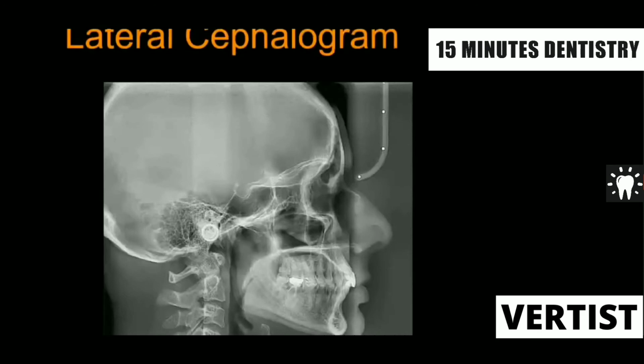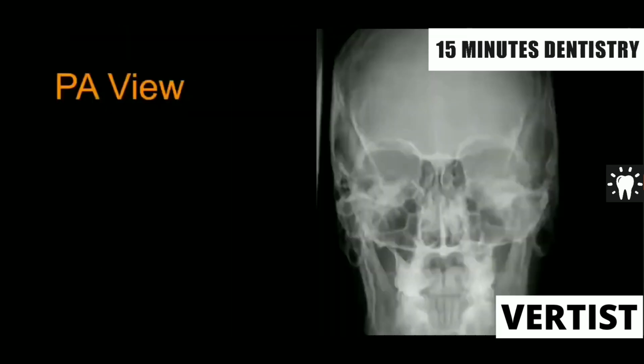So this is the lateral cephalogram, which we routinely take for orthodontic treatment, before the orthodontic treatment, to calculate the bone level, the amount of bone, and to decide the treatment plan. You might have studied this in more detail in your subject of orthodontia.